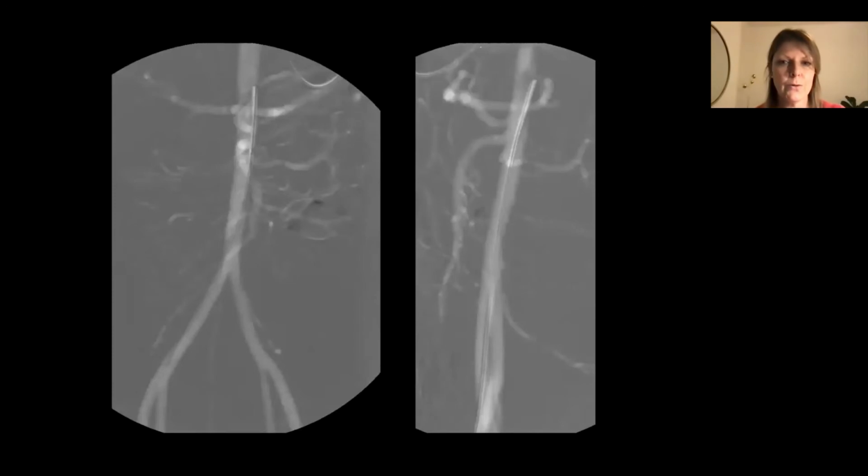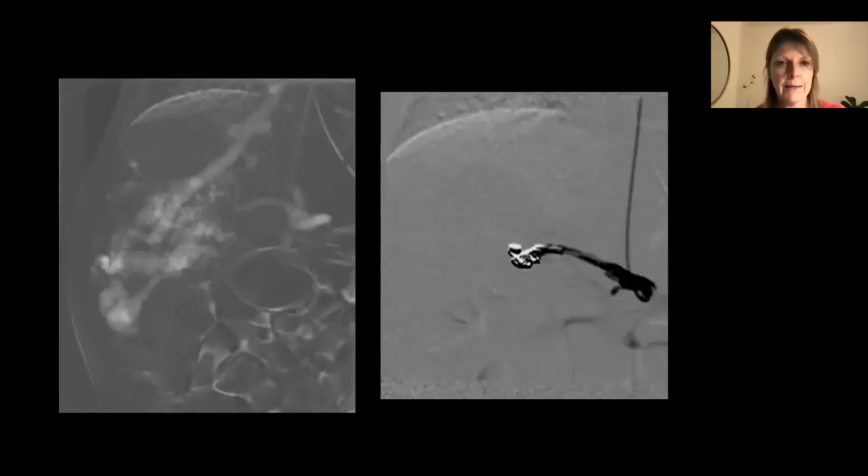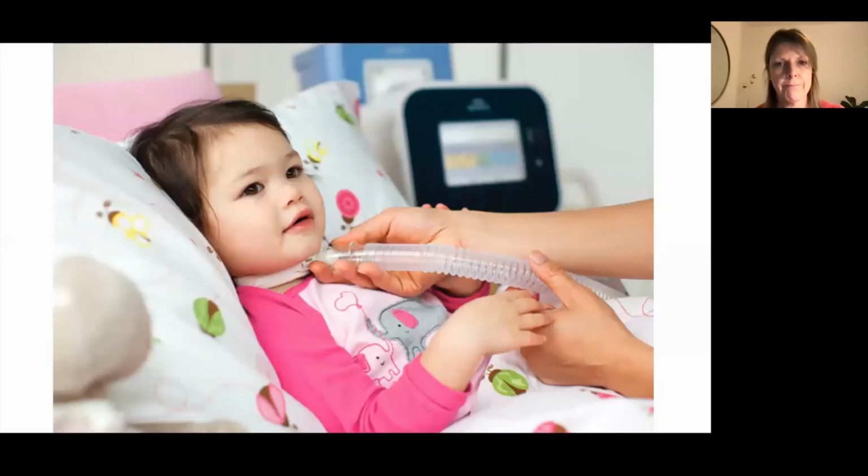In an older child here, we've approached that really differently and used carbon dioxide angiography instead of fluid contrast to image the aorta here. Really beautiful pictures. This means the kidneys aren't knocked off by using iodinated contrast, and we're not fluid overloading the child. Finally, this is another child with a liver tumor here, again in cardiac failure, and we've used CO2 angiography on the left-hand side to image the center of this shunting lesion, and then gone on to use contrast when we've actually done the coil embolization.